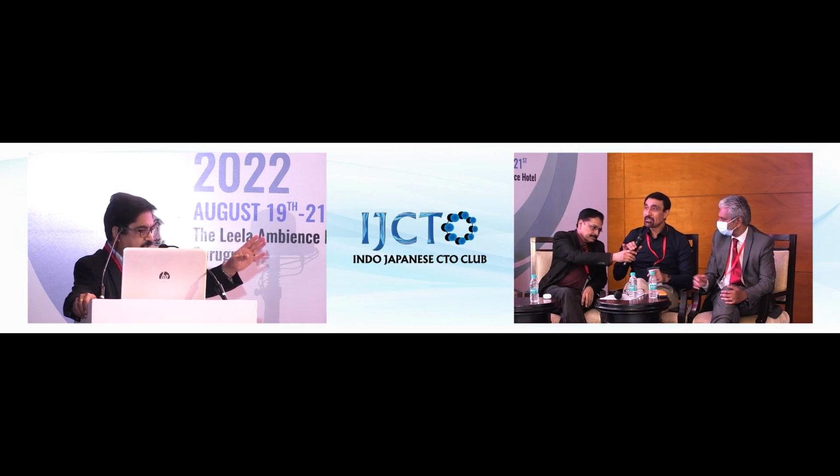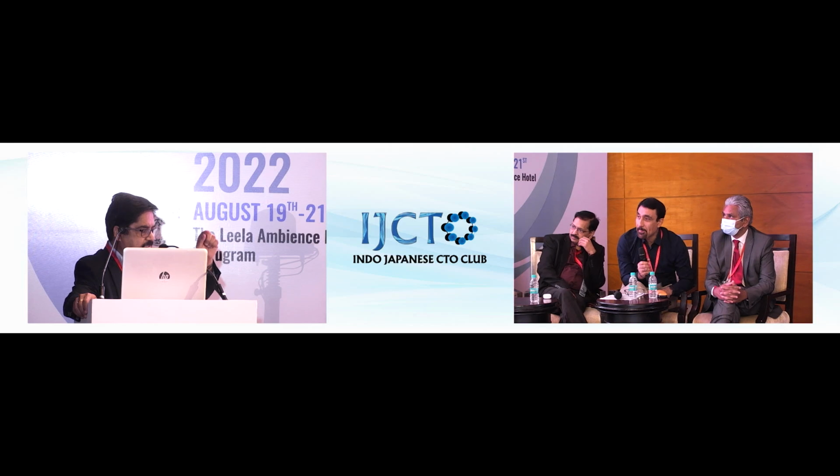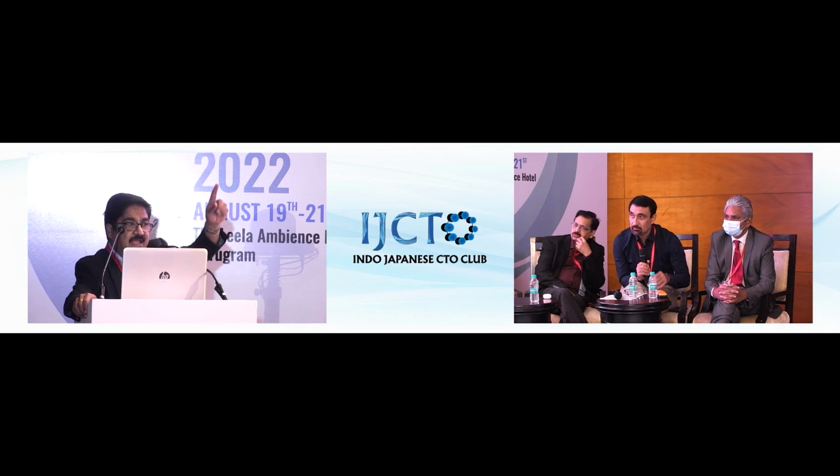Actually, just talking on that feel of the wire, I think it is very important to get the tactile feedback. And today with Gaia type of wires, it's very important to see and understand that if I have rotated it 45 degrees, has that rotation happened at the wire tip or not? If it has happened, you're probably in the right plane. If it is not happening, that means you are stuck somewhere and you better not do more. So that is a very important tip to catch on.